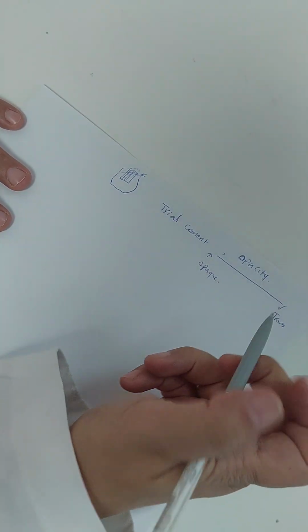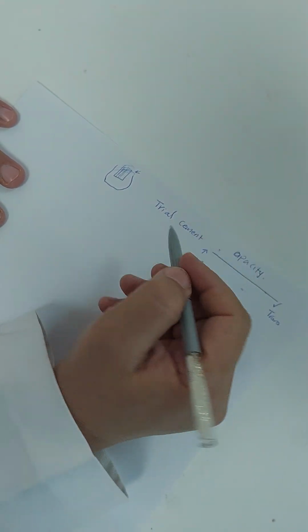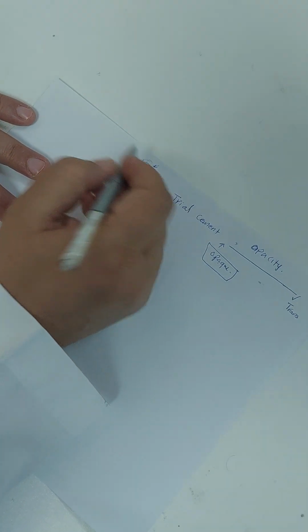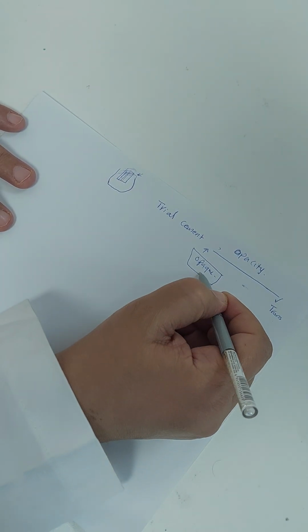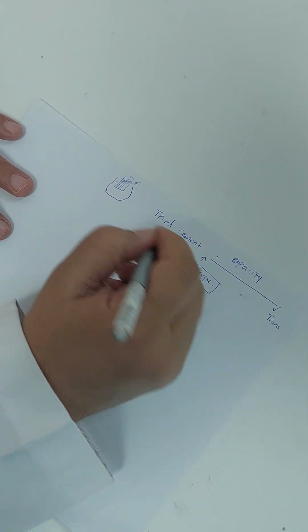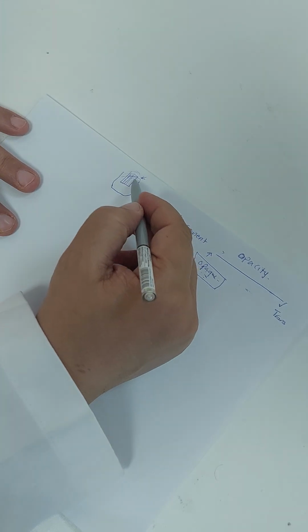So the gradient is an opacity gradient, and doesn't add any color. In her case, we also added the most opaque trial cement and watched the tooth. Still the grayish color was showing through, even with the opaque cement. So it's not an issue of opacity, it's an issue of color. We need to mask the color.